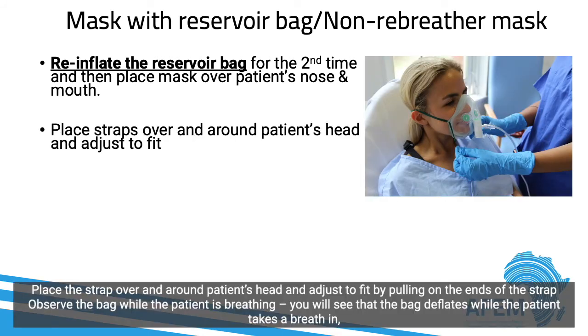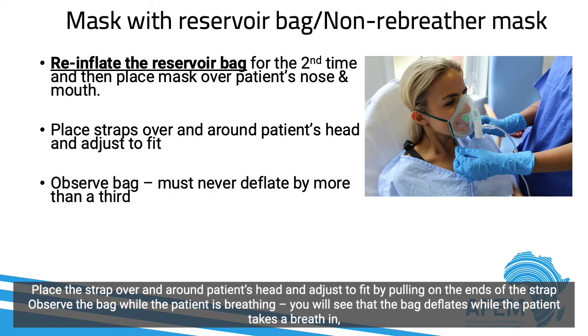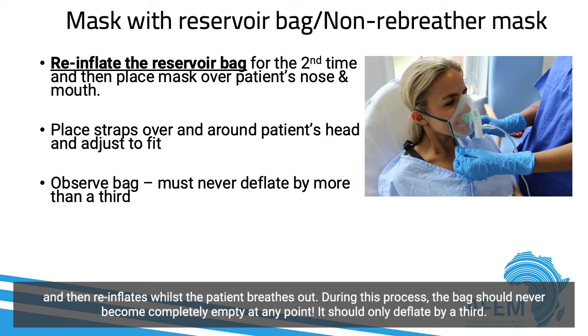Place the strap over and around the patient's head and adjust to fit by pulling on the ends of the strap. Observe the bag while the patient is breathing. You will see that the bag deflates when the patient takes a breath in and then reinflates while the patient breathes out. During this process, the bag should never become completely empty at any point. It should only deflate by a third.